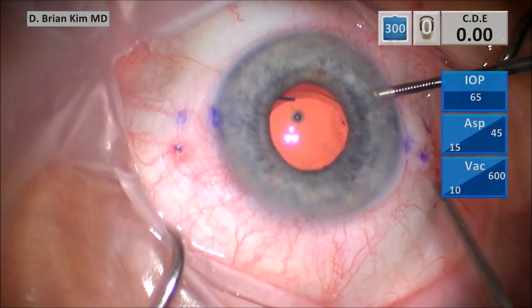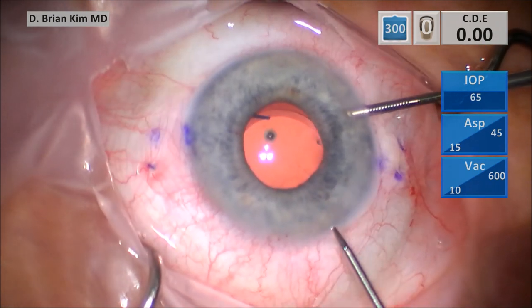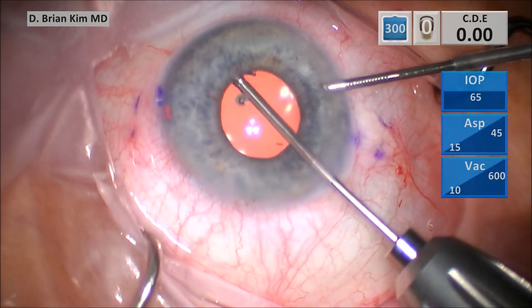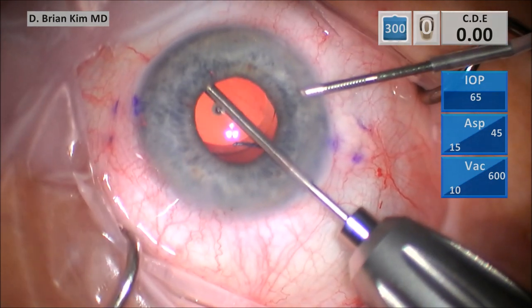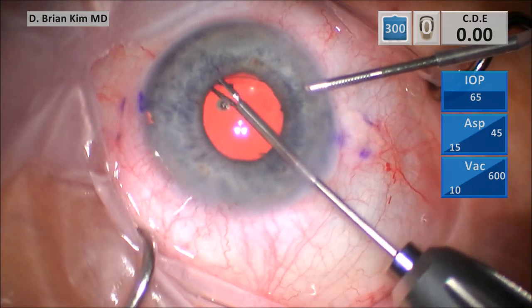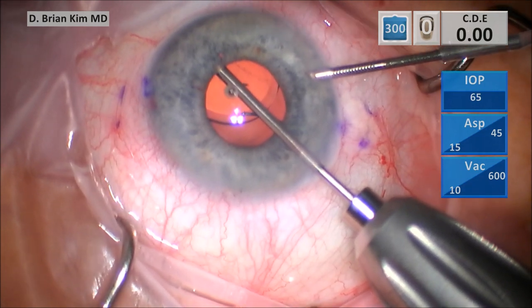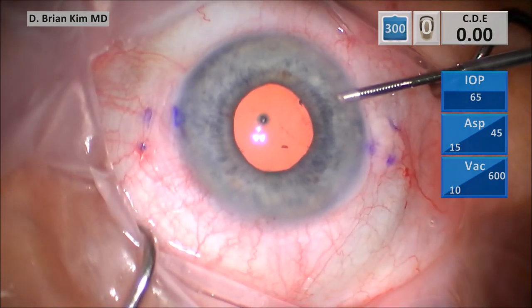After I place the haptics in, you can see there's slight decentration — the left-sided haptics are longer and pushed out more. The way you fix this is to use micro graspers and just pull on the haptic so that it stretches, essentially pulling on the haptics in order to create a more symmetrical haptic length on each side. And as you can see at the end of this manipulation, the haptics are in a much more even position and the lens is well-centered.